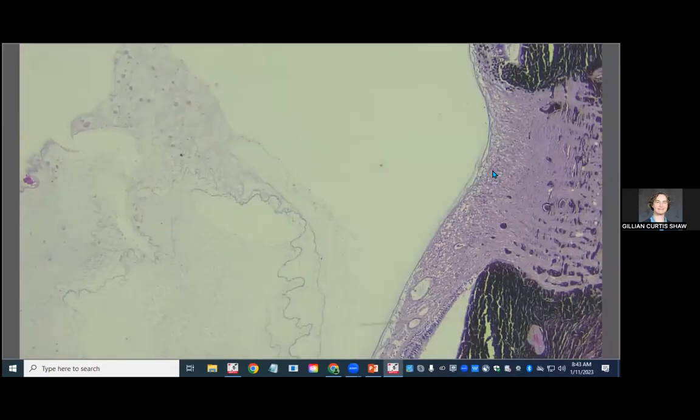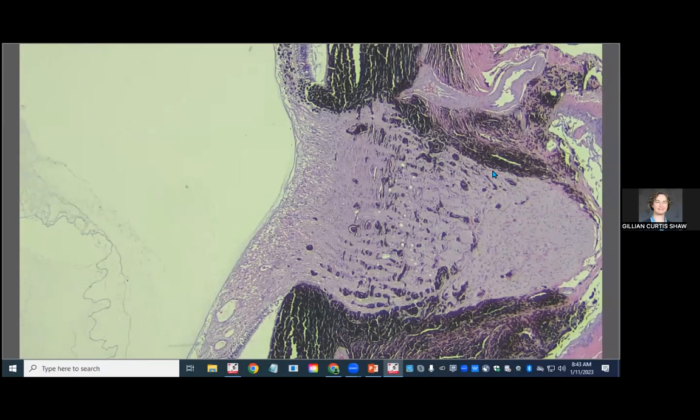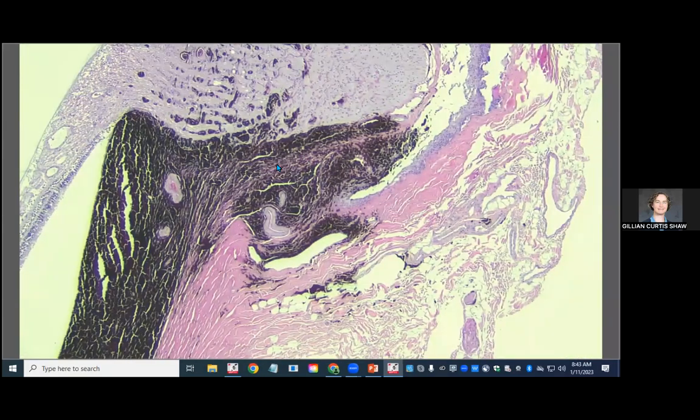There were slightly decreased numbers of retinal ganglion cells, but the optic nerve head itself looks pretty normal. At this mag, you can also appreciate how heavily pigmented the beams of the lamina cribrosa are. So there's really just tons of pigment everywhere. And then you can also see how much pigment there is tracking along the optic nerve outside of the meninges and inside the meninges.